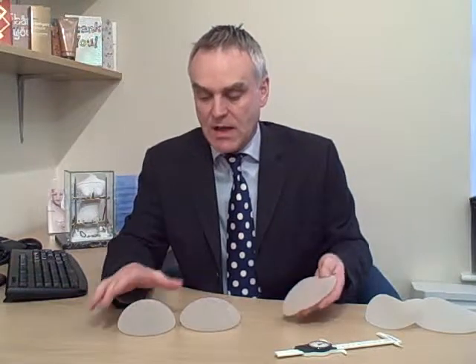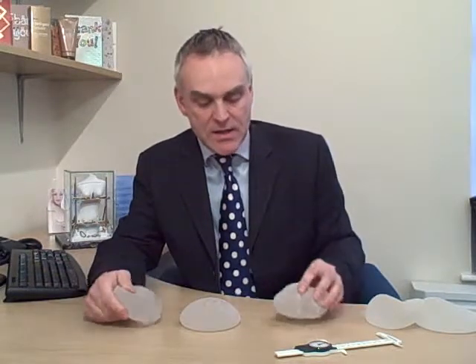So in my practice, I typically perform over 250 breast implants a year. The majority of people, probably 60 to 70%, would go for the full projection. People who want to be very subtle and want a very gentle breast augmentation tend to go for the medium height, medium projection, and people who want more of a dramatic look go for the extra high. So again, just to summarise, the base width of the implant is governed by your chest diameters, and then we have a discussion about the projection you would prefer.